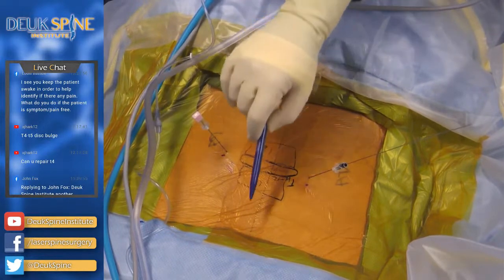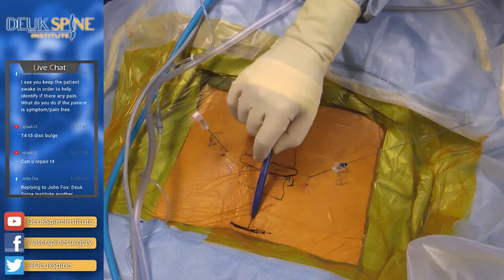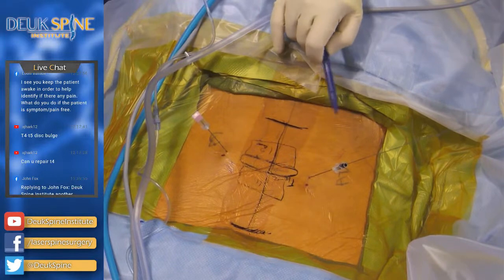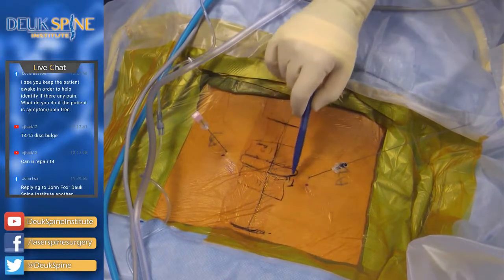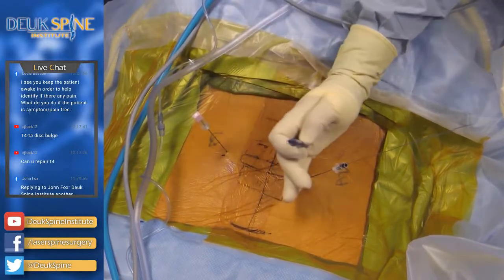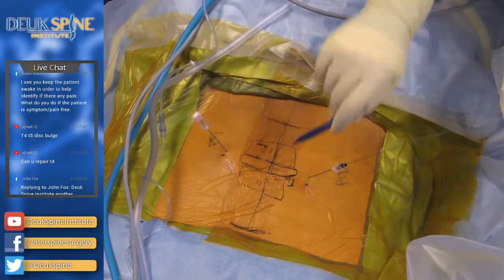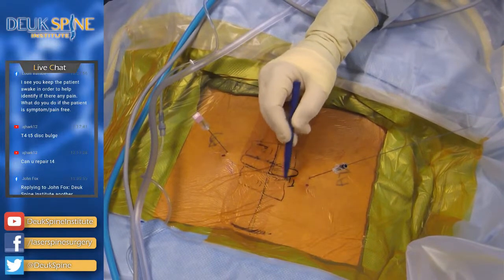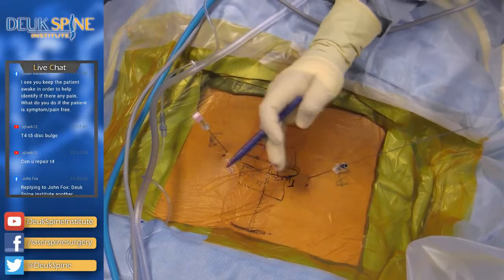So normally the incision would be from here, you guys see this up here, down to about here. Okay, that would be the normal incision. And the whole muscle, the muscle that runs down the side of the spine right here, has to be peeled off of the spine and pulled way over to here, so that the surgeon can go this way, transforaminal, transpedicular. The bones in the back of the spine would be removed back here, taken out, osteotomized.